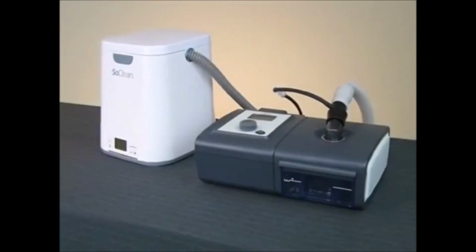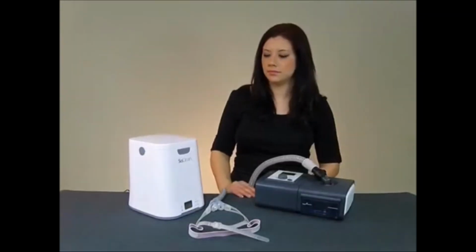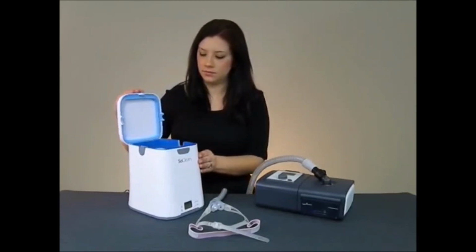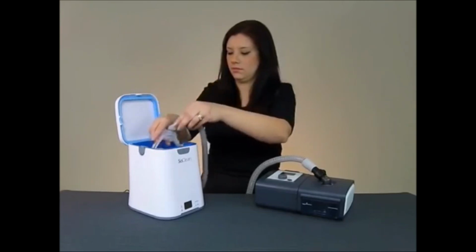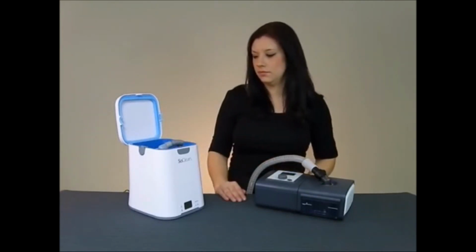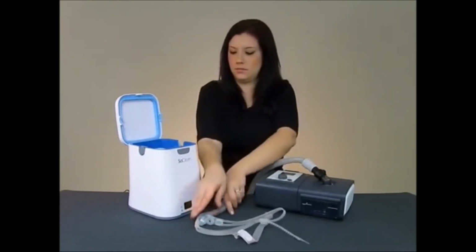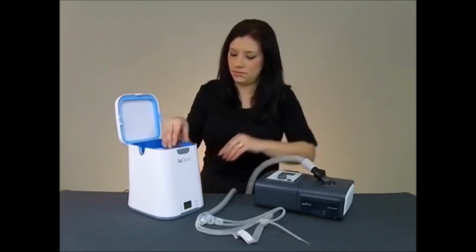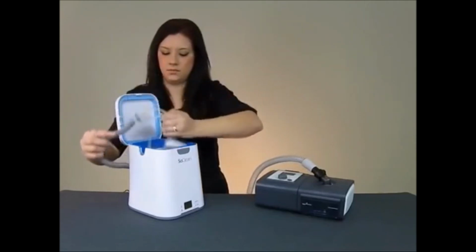After the initial setup, using your SoClean is extremely easy. Begin by opening the lid and placing your mask into the chamber, allowing its attached hose to rest in the open hose slot. The SoClean gives you the option of inserting your mask and hose from either side of the machine. To change sides, remove the hose slot plug from its position by lifting it straight out and inserting it into the slot on the opposite side.